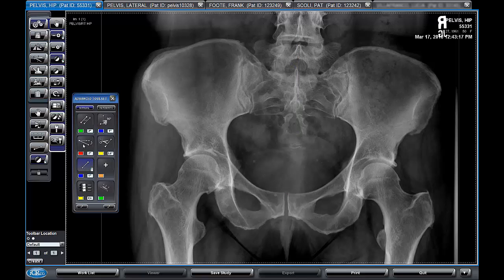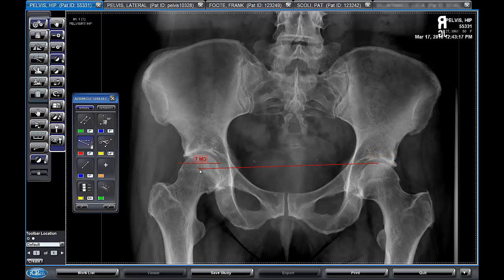The horizontal offset line is a tool that will give you the vertical distance between two points. That second line in the measurement is always placed above the lower point.